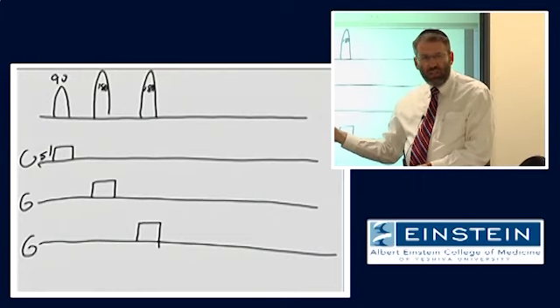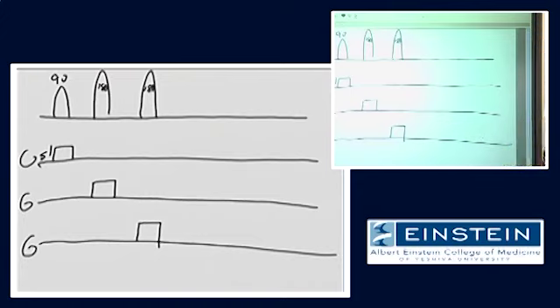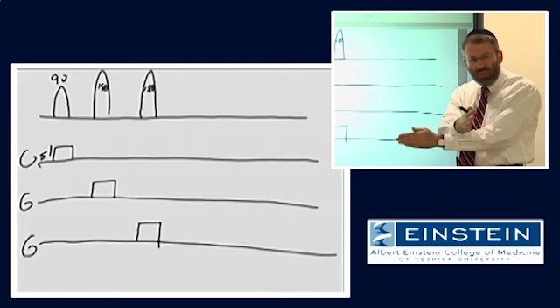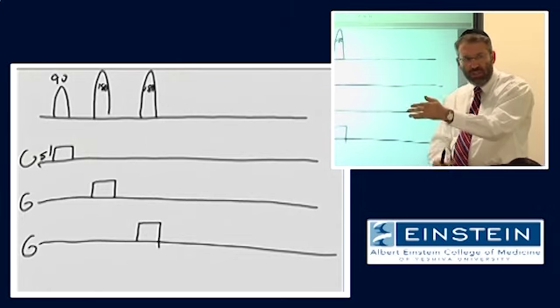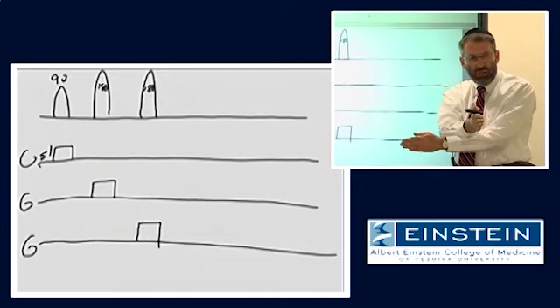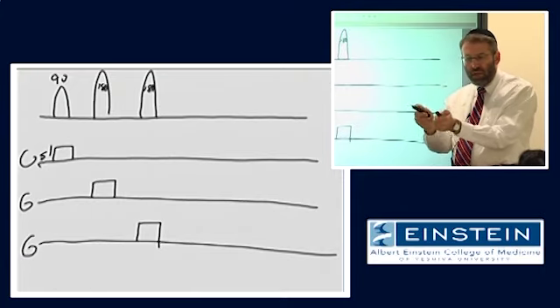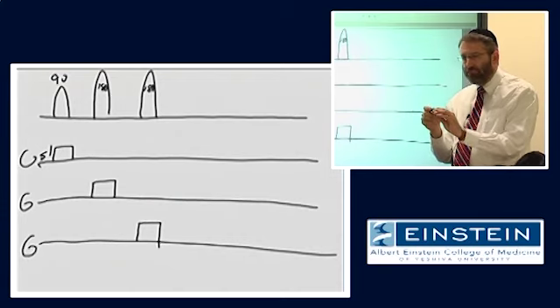When we apply the second RF pulse, which is a 180 degree pulse, it's also slice selective, but it is slice selective for a slice that is orthogonal to the first slice. What that means is that the only spins which see this 180 degree RF pulse are the ones along a column of tissue in the slice that we just selected. So the spins at the intersection of these two slice selections are refocused, right? And they see that 180 degree pulse and generate a spin echo at some point later on.